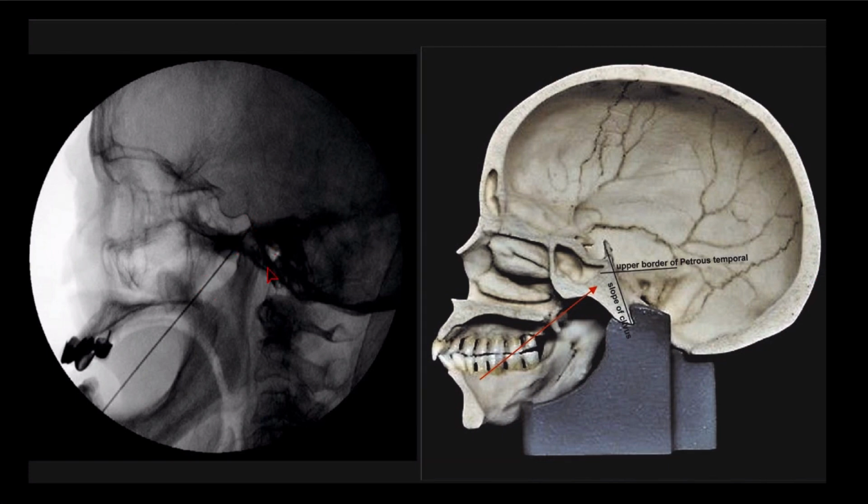So that's the clivus. So in the lateral view, you should always keep the C1 in your picture. Once you keep the C1 in your picture, you can imagine here is the foramen magnum, just the anterior border of the foramen magnum. You can imagine this is the clivus, slope of the clivus, sella turcica. Okay, this is the petrous. So clivus and petrous junction.